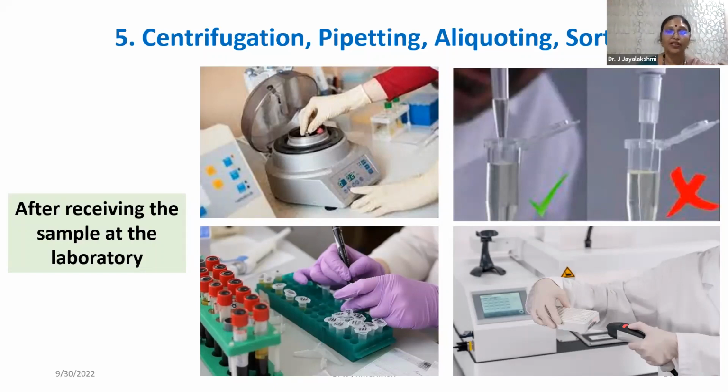And also the temperature at which they are being centrifuged, whether it requires a refrigerated centrifuge, is it there? Sometimes it ramps up late and then it stops slowly, so the entire process would be for 1 minute or so, and then it's not doing its work well.